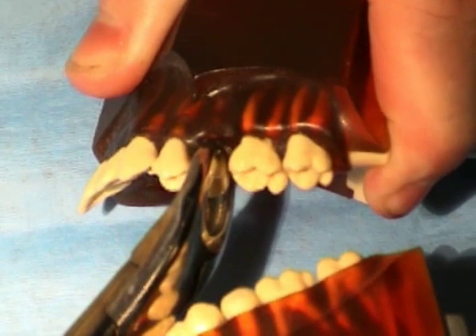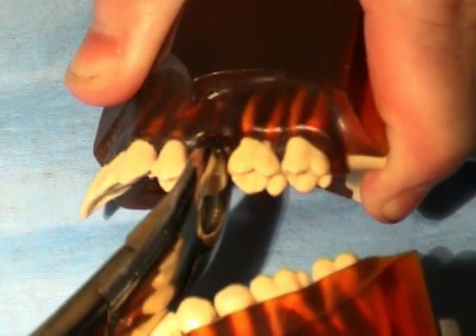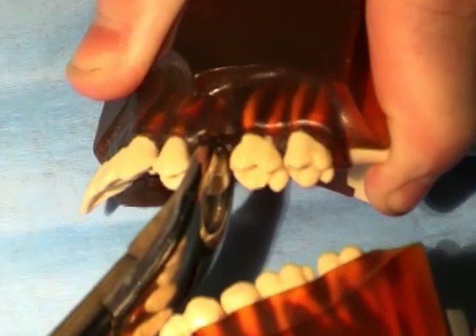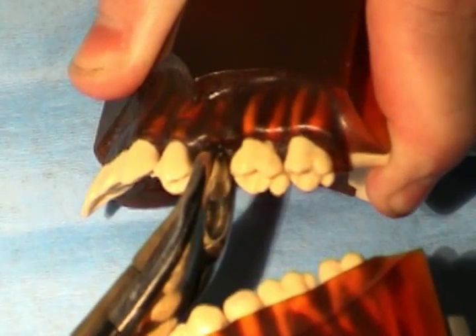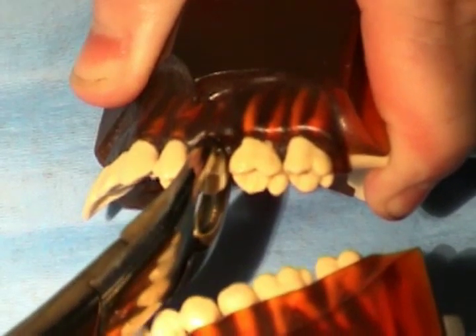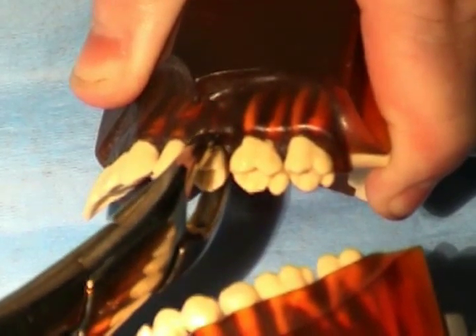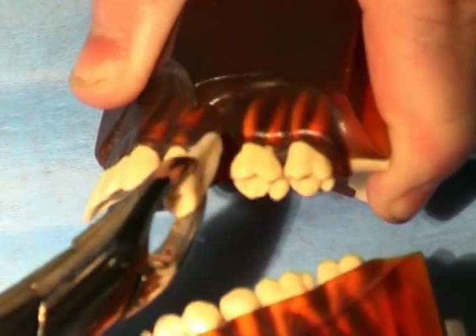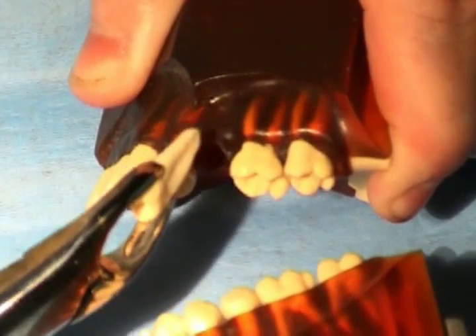Now buccal and lingual pressure is applied to expand the buccal and lingual bone. If there is a lot of resistance to this pressure, the expansion of bone can be facilitated by applying and holding the pressure for a few seconds. The majority of the forceps movement should be applied in the direction where the bone is thinnest.